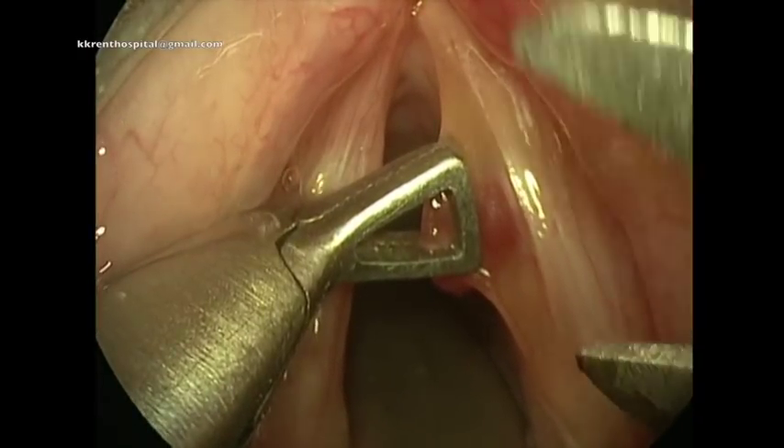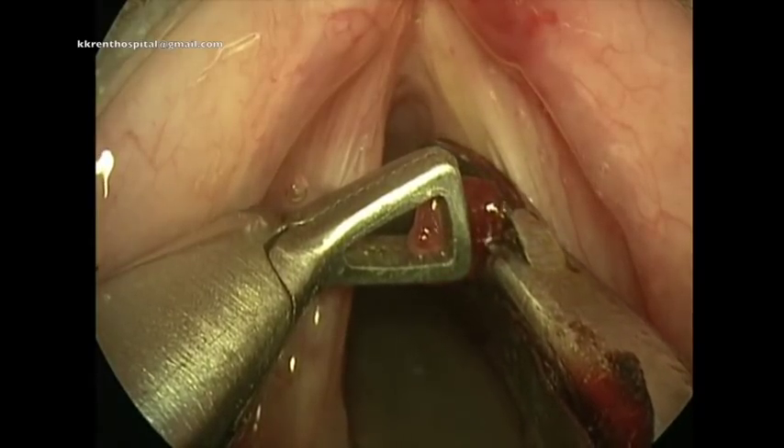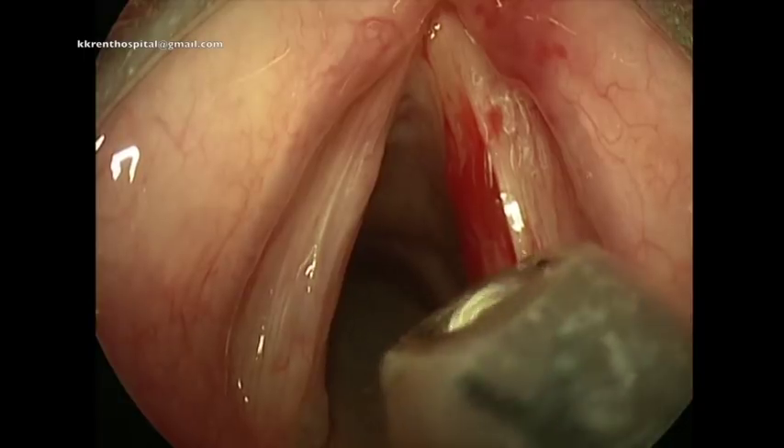The polyp is grasped with the suitable forceps, and using cold steel, the polyp is excised. It takes less than one minute for the procedure.